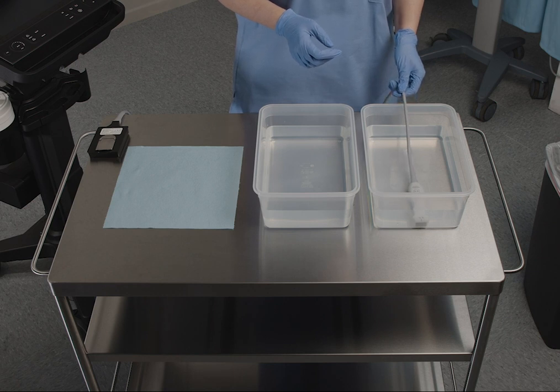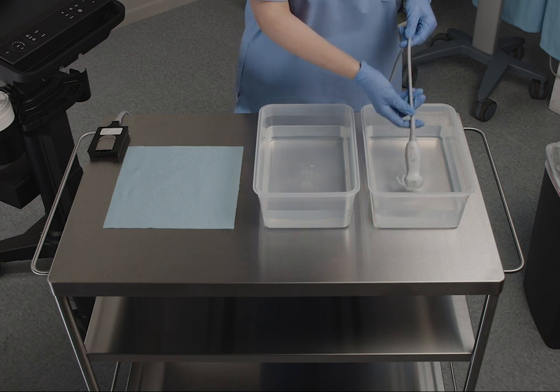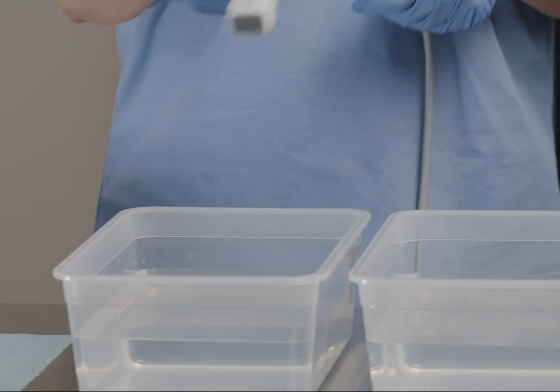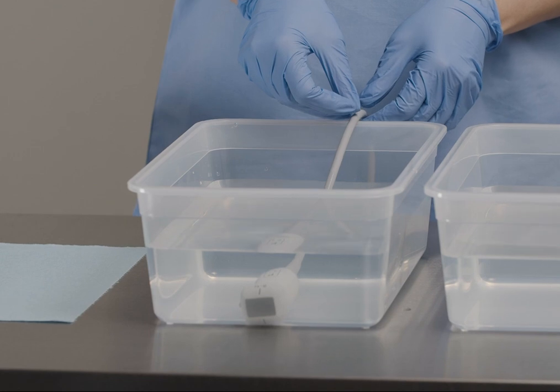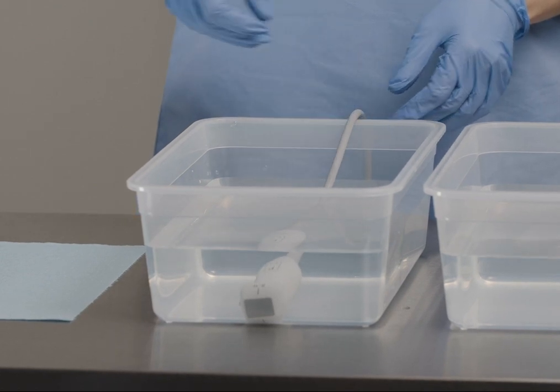Follow the instructions on the disinfectant label to see how long to leave the transducer immersed. Using the instructions on the disinfectant label, rinse the transducer in clean water, making sure that the connector and most of the cable remains dry. Repeat this step until the transducer has been rinsed three separate times.